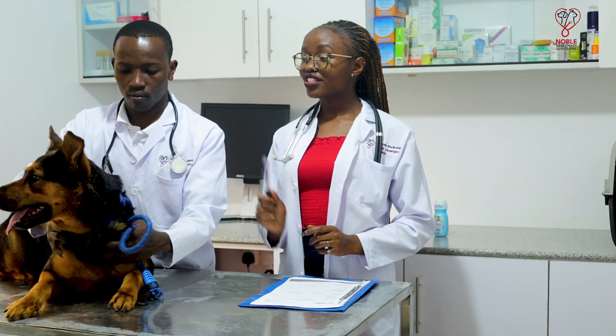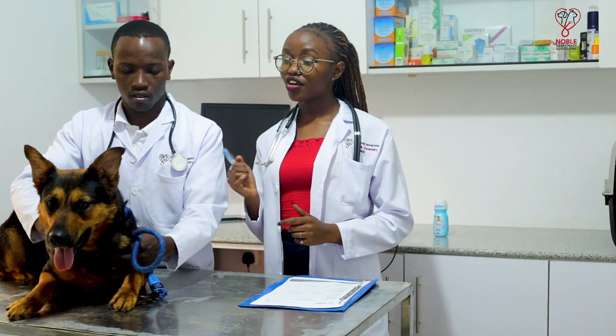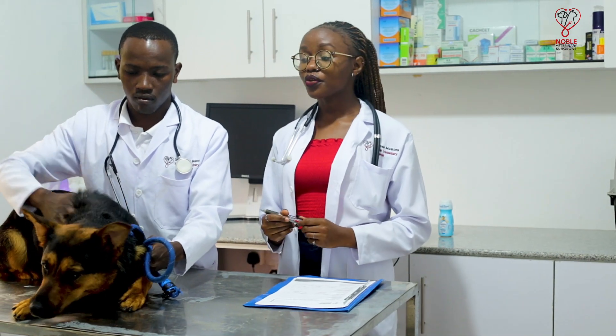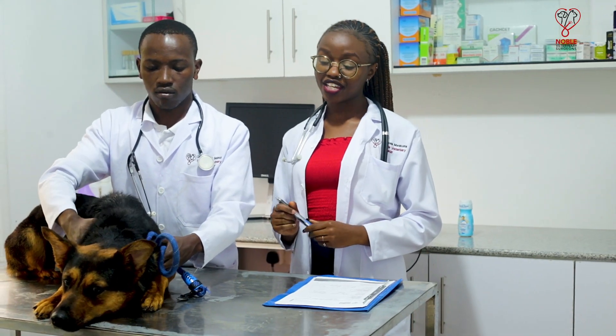Hi guys, I'm Dr. Rose Mokoma and last time we took you on a tour of our clinic. Today we'll be showing you how to examine an animal. Today we're here with Deva, our patient, and Dr. Dan as my assistant. And we're going to show you how to carry out an examination on an animal.